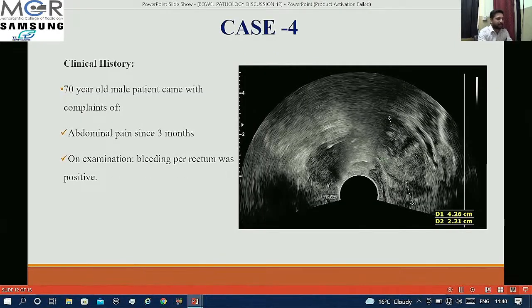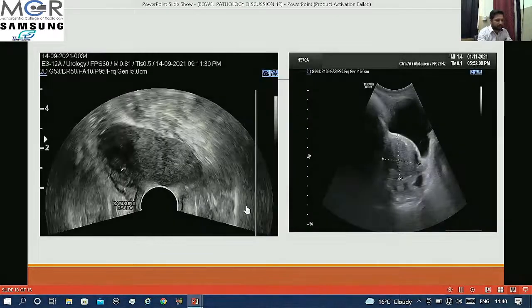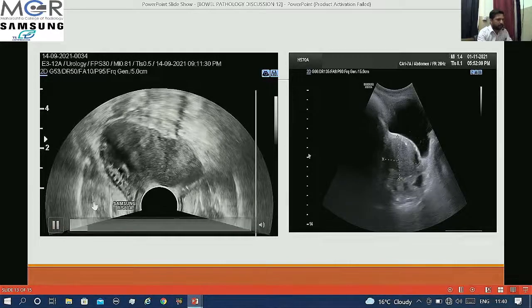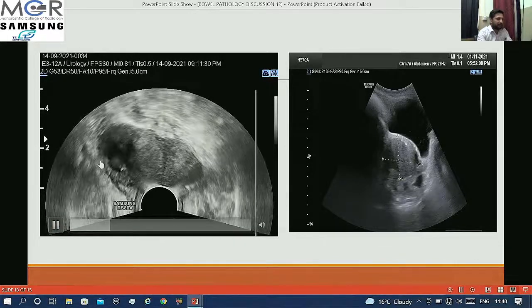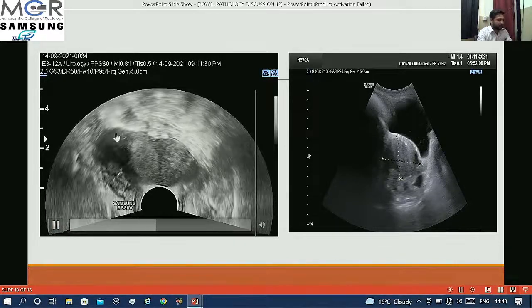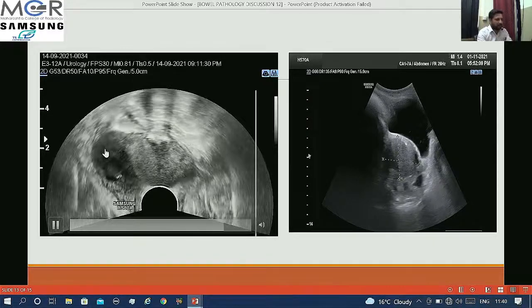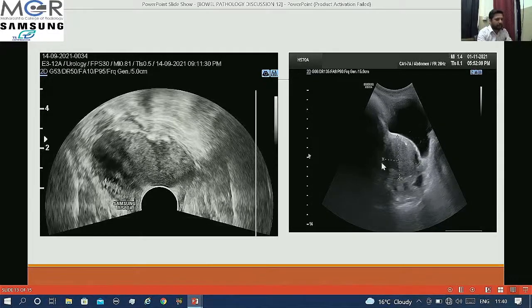This is the last case. A 70-year-old male patient came with complaints of abdominal pain since 3 months. He was also having bleeding per rectum. On transrectal ultrasound we can see that there was an intramural endophytic mass lesion within the rectum with significant thickening of the rectal wall. On transabdominal scan also we can see the findings.